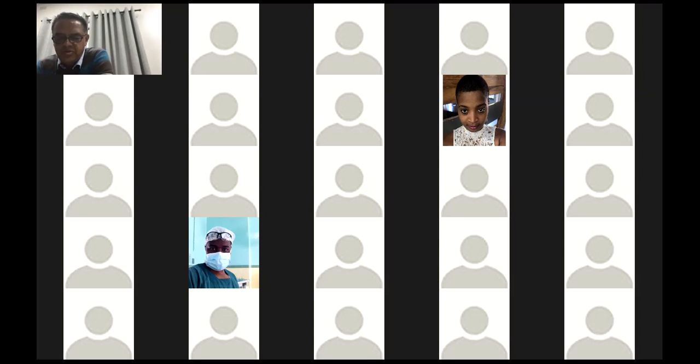With the use of allograft in Zimbabwe, it's near to impossible to get allograft. Fortunately, when you're doing these patients, the first thing you do with a hip replacement is you remove the femoral head, and that gives you a lot of bone graft to utilize during the procedure. So I've never found the need for allograft. And the second thing is allograft has essentially been overtaken by trabecular metal implants. So it's hardly ever now that surgeons are using allografts for this procedure.